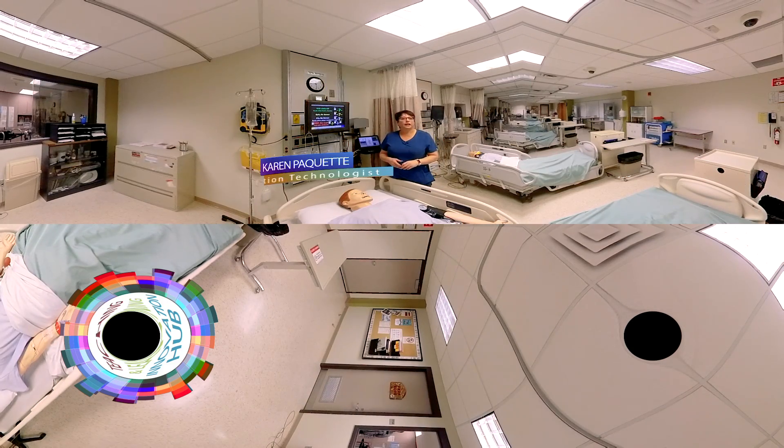Hi, welcome to The Sim Lab. Today I'd like to teach you how to do blood pressures on the mannequins.